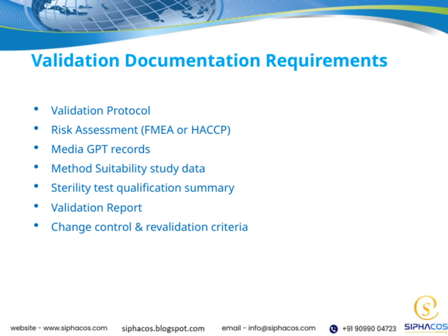This is crucial because it confirms that our methods are appropriate and reliable for our specific application. We also include the sterility test qualification summary, which summarizes the validation of our sterilization processes to ensure they meet required standards. The validation report ties everything together. It provides a comprehensive overview of our validation activities and results.